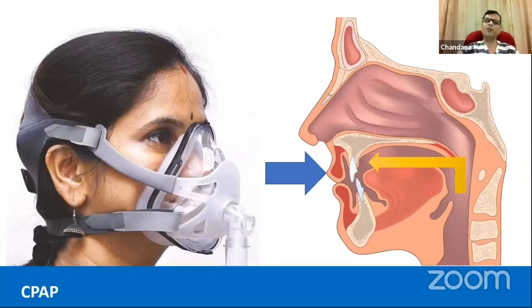CPAP is not actually a very big deal because the pressures we use in CPAP are generally slightly lower values. Patients can still breathe in and out, but it won't help to increase minute ventilation a lot because exhalation is slightly affected. In certain patients it can affect the washout of carbon dioxide. But generally, this will help the patient to have a higher lung volume and sometimes can recruit certain collapsed alveoli because of the positive pressure.